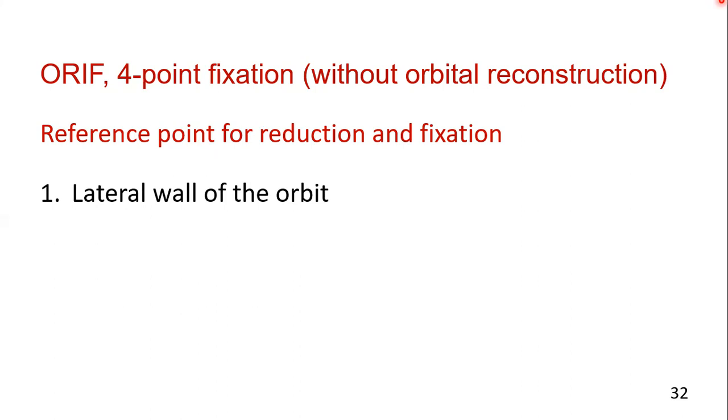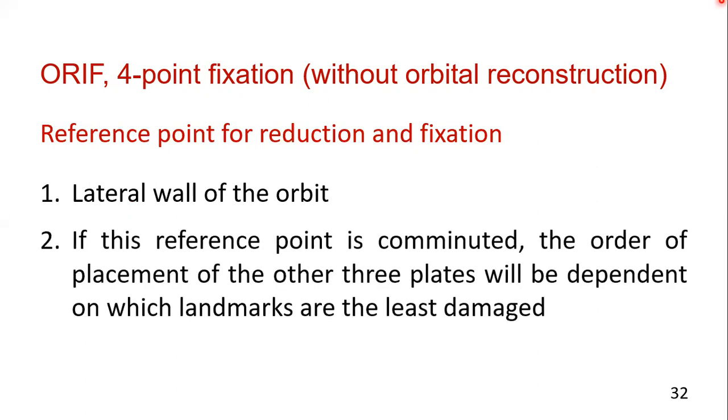Whenever possible, the surgeon tries to achieve a perfect reduction of the lateral wall of the orbit. This requires the alignment of the greater wing of the sphenoid and zygoma.